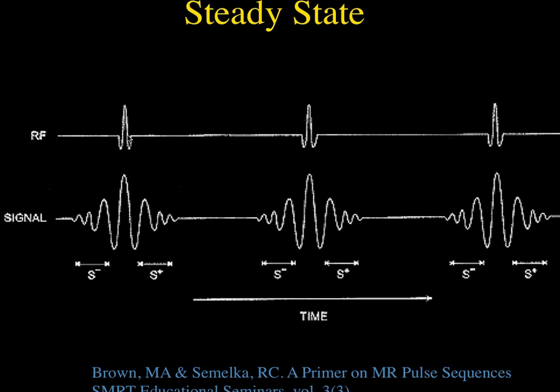this pulse will flip nuclei a little bit. These typically are low. They're not 90-degree pulses. They're 15 to 30 degree pulses or less. This will cause some of the nuclei to flip into the XY plane. This will rephase them, getting the echo here. But this one, though, was the rephasing pulse for some of the spins. It's going to be the initial pulse for others. And you basically then end up with a series of echoes that are typically centered around the pulses.